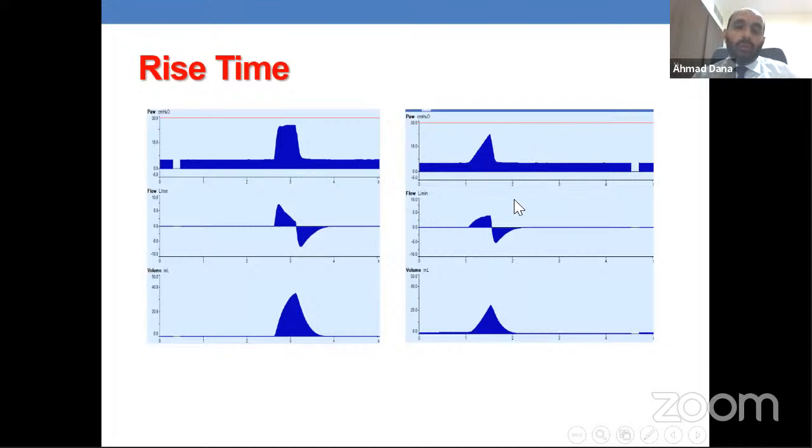One more thing to keep in mind. Sometimes there are some machines where, as we mentioned initially, to generate a pressure in the machine, you have to have a good flow. Now, on some machines, the flow of gas in the ventilator you need to set yourself. It's not set automatically. So you need to set a proper flow so that the machine will generate pressure.